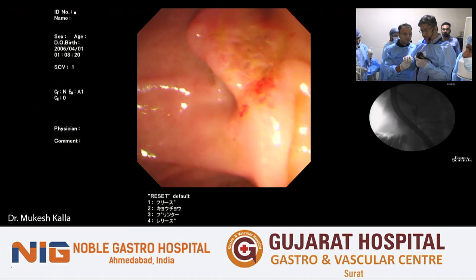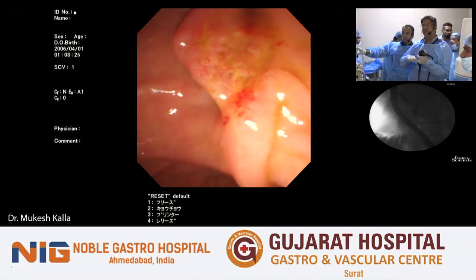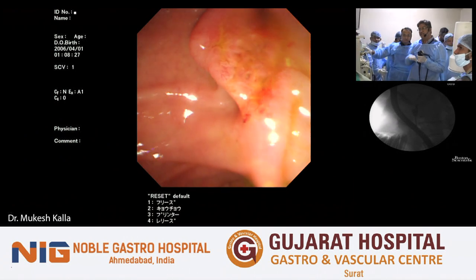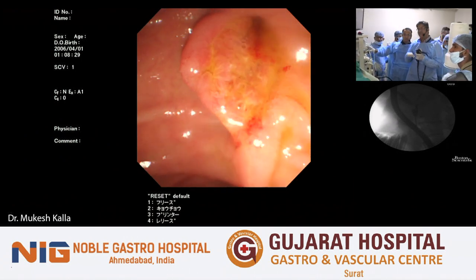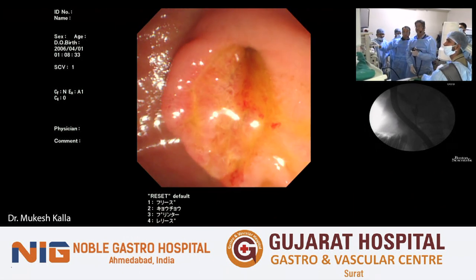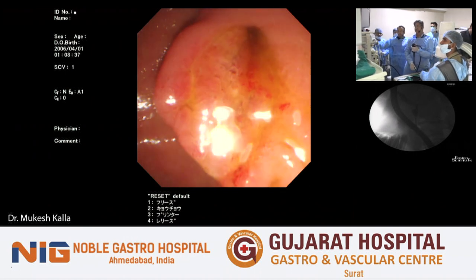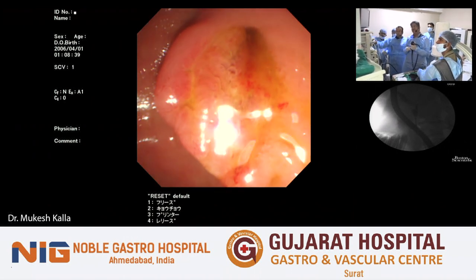This cholangiogram shows that this patient has a dilated cystic duct. And within this dilated cystic duct, we have a small stone which we were able to see and which is compressing the common hepatic duct, probably a post-cholecystectomy retained cystic duct stone. We can call it type 1 Mirizzi as well.